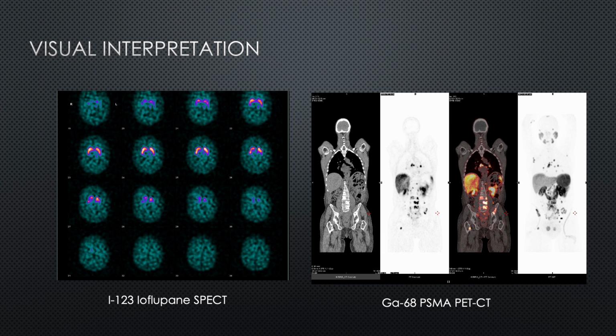Or in this gallium PSMA PET image, where uptake can tell us about the extent of the primary tumour and whether disease has metastasized or spread to the lymphatic system. This is perfectly adequate in that we do not necessarily need quantification, just the presence or absence of radiopharmaceutical.